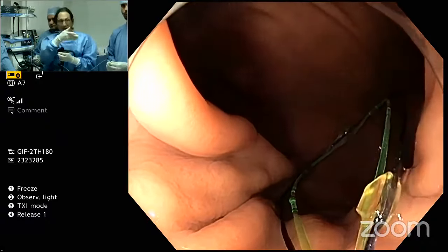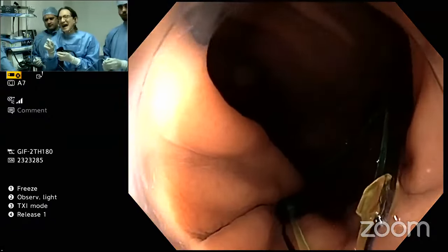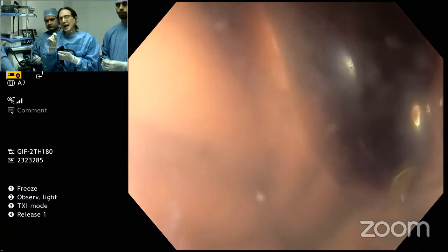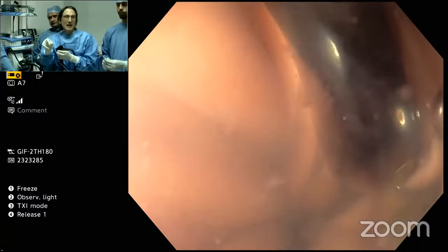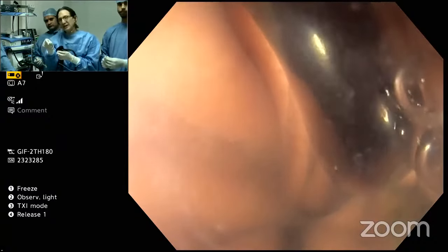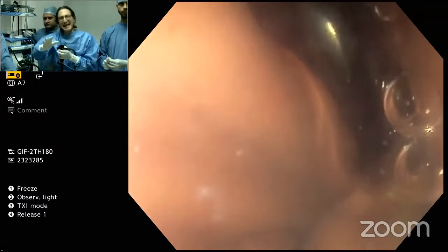Yesterday, you heard about, this is from Dr. Puri, his idea about a loop with a nitinol wire inside. I thought of that idea too. The problem with that is that if you have wire, you can't cut through wire, but also there's the risk that you can conduct if for any reason there is a disruption of the coating, the plastic coating of the loop. The wire's on the inside in the core, so there's the potential if you're going to, for example, snare above the loop and the diathermy gets to that inner core, the nitinol, then you're going to extend the diathermy to the deeper layer. And that will not be good.